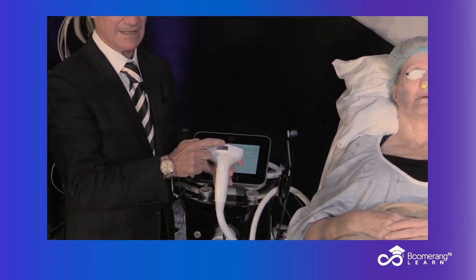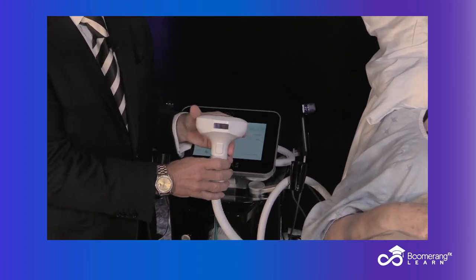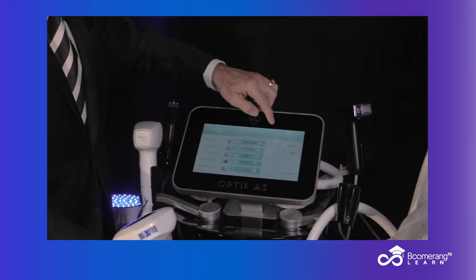You have the light guide. You have the xenon flash lamp. And we're going to go back now.